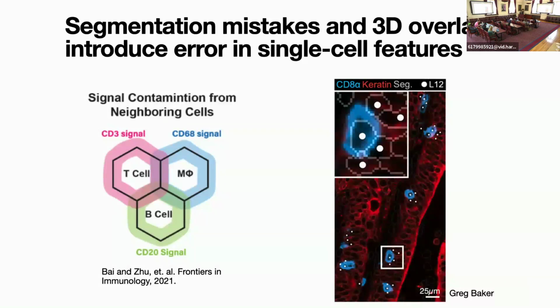So one of the problems you start to see, as I mentioned a little bit, if you analyze these cells as though they're 2D images and you're trying to figure out, well, if I see intensity in this pixel, it belongs to this cell, and if I see intensity up here, it belongs to this cell, is that there are cells on top of each other and crowding, and you may not even have a whole cell. It's sort of not a well-founded problem.